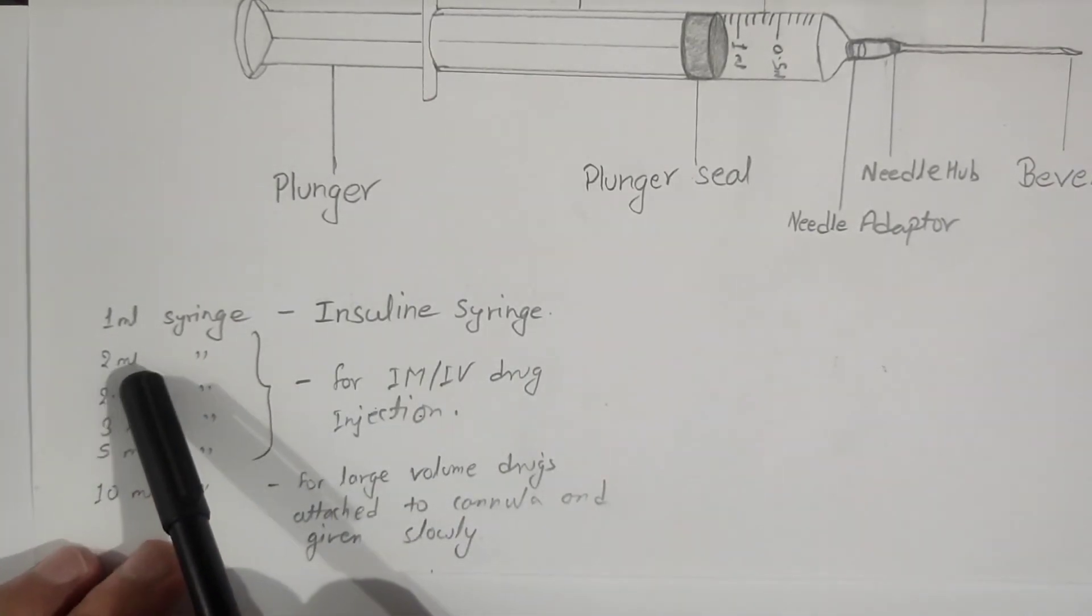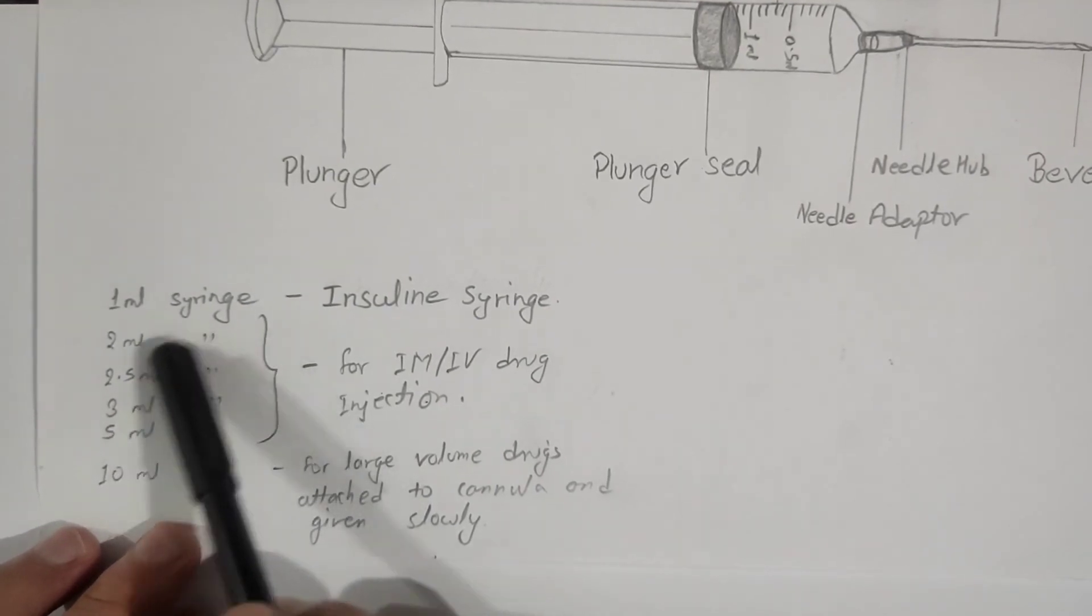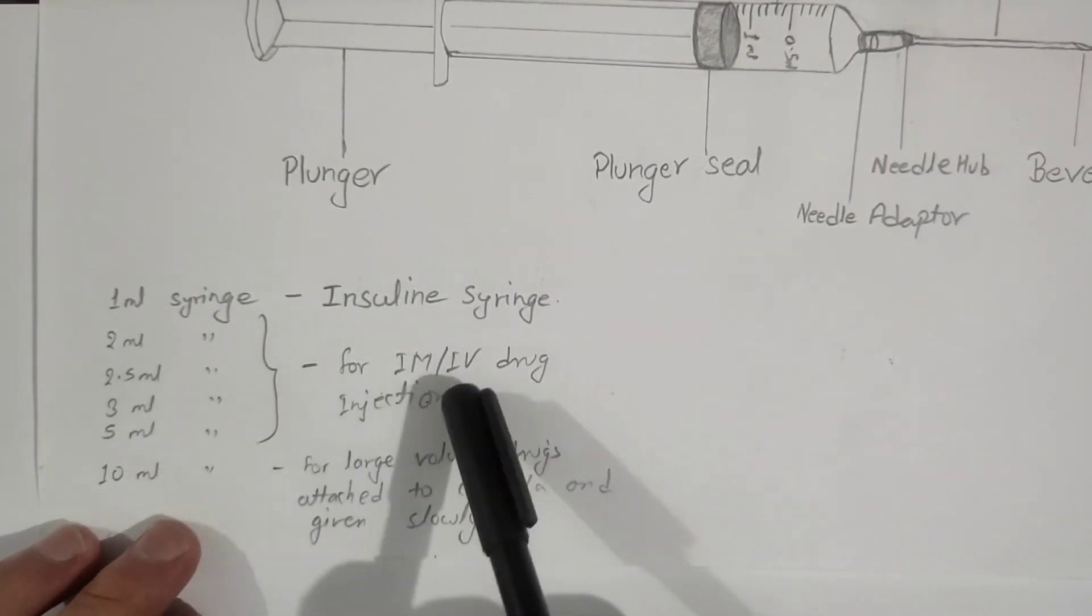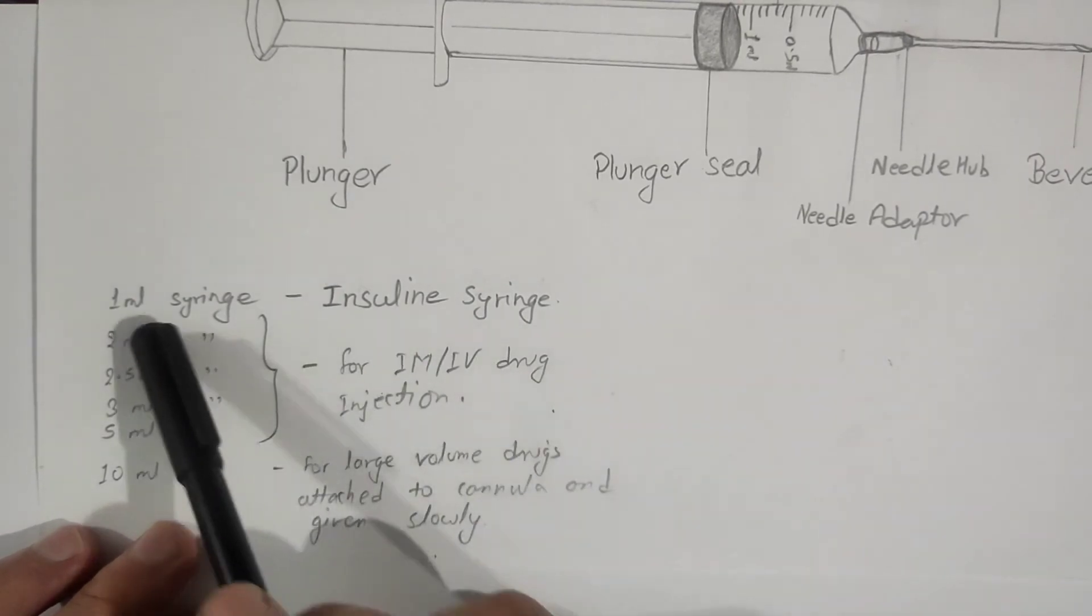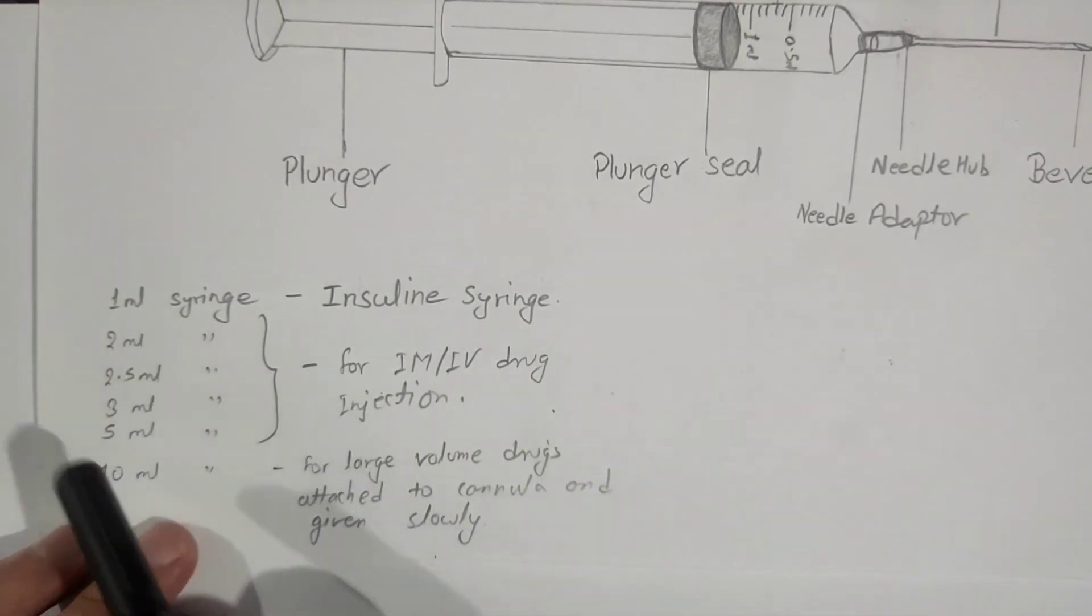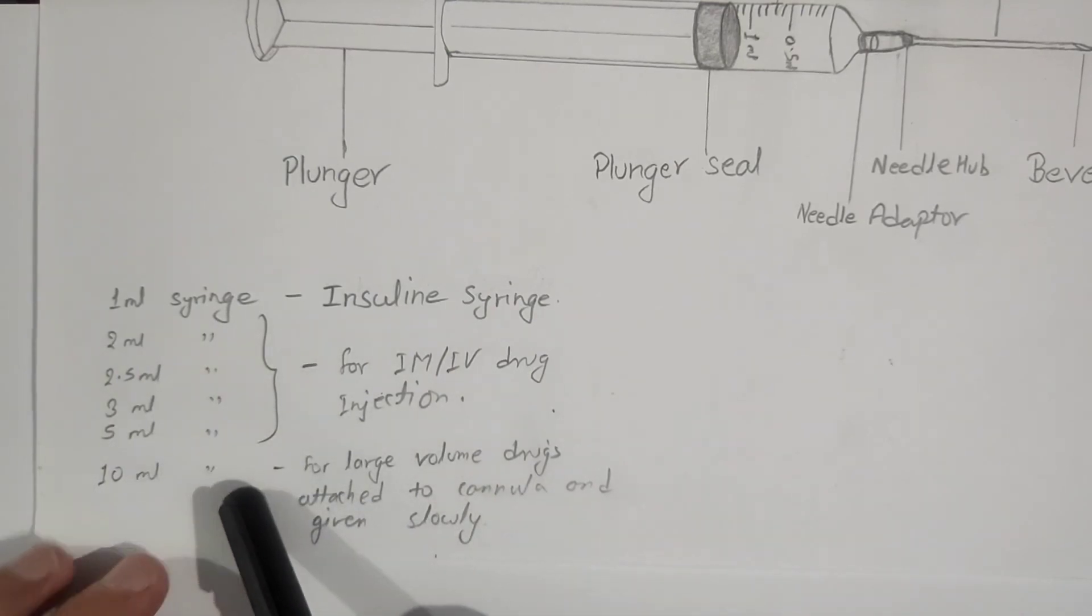Another type includes 2ml, 2.5ml, 3ml, and 5ml syringes. These syringes are mainly used for IM and IV drug injections. It depends on the volume of drug we are going to inject.